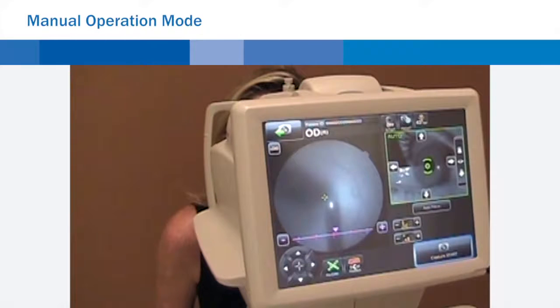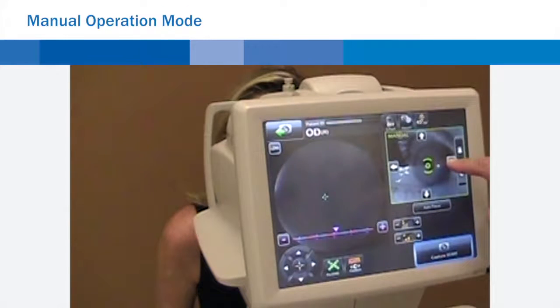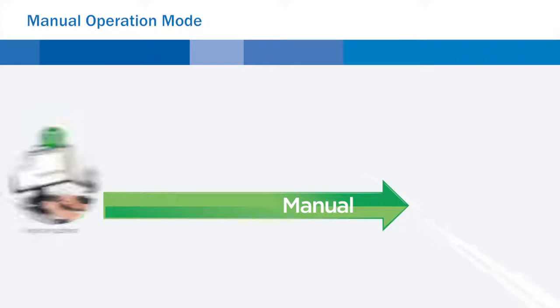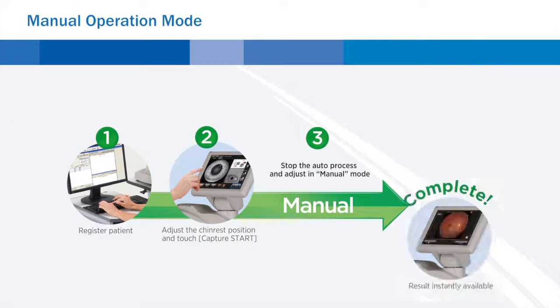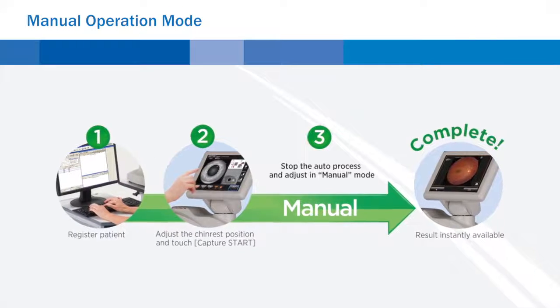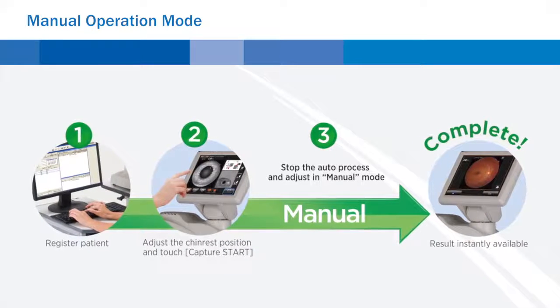In manual operation mode, the operator can drive the camera using the touchscreen as if via the control lever. This is particularly useful in cases where auto mode is not possible, or a specific area of the fundus requires illustration. In manual mode, alignment is adjusted by a finger touch on the screen, and illumination, flash intensity, diopter adjustment, and internal fixation targets can be adjusted.